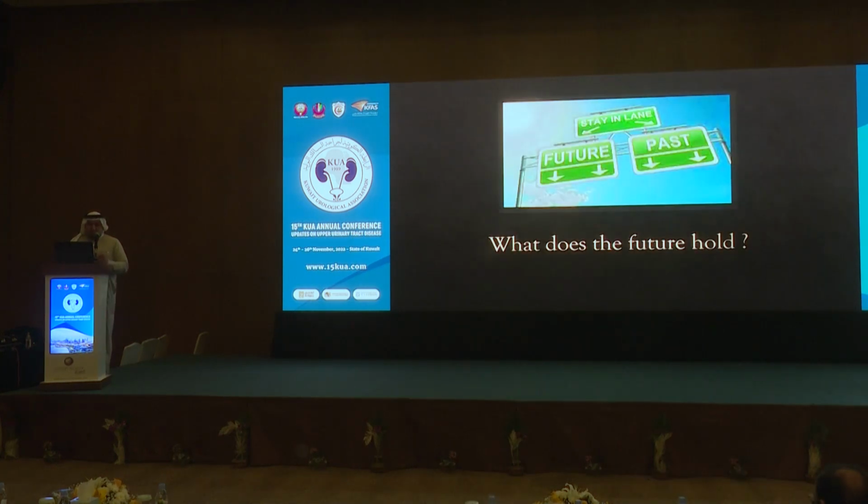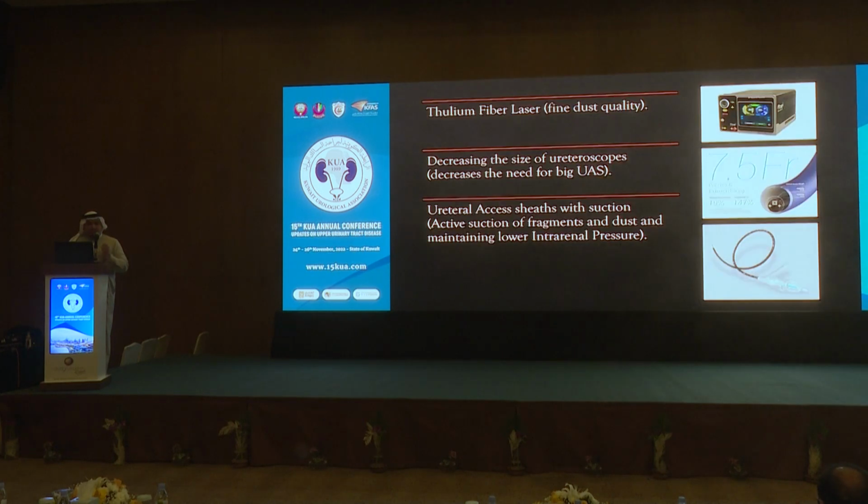So, what does the future hold? Dr. Hassan Razvi was speaking about the thulium fiber laser. As we mentioned, one of the biggest problems in the horseshoe kidney or ectopic kidney is the drainage of the fragments. So we always aim to clear the patient. But maybe with the TFL, we can produce this fine dust, and we don't need to go with the basketing, and we can go faster.